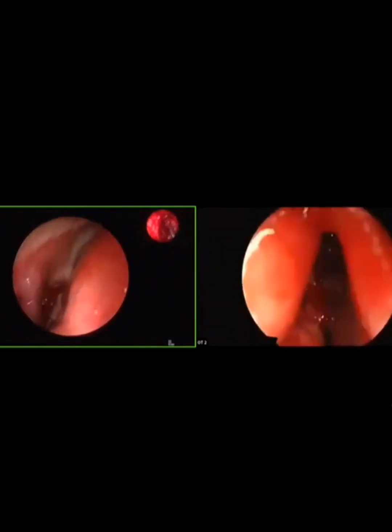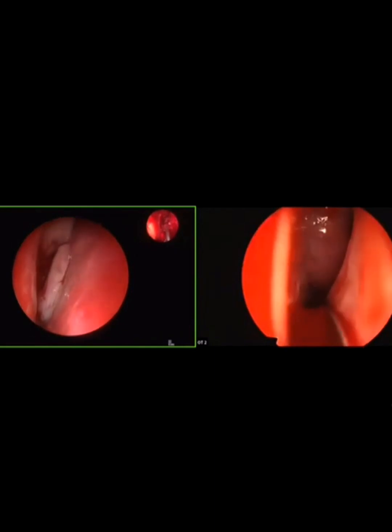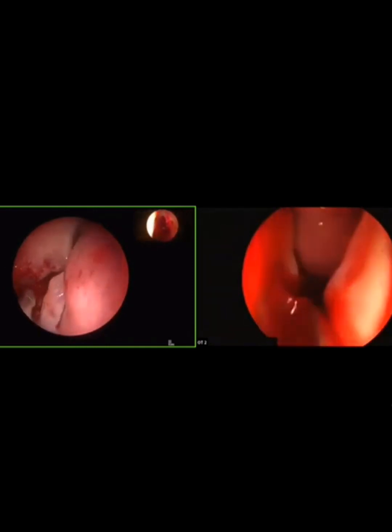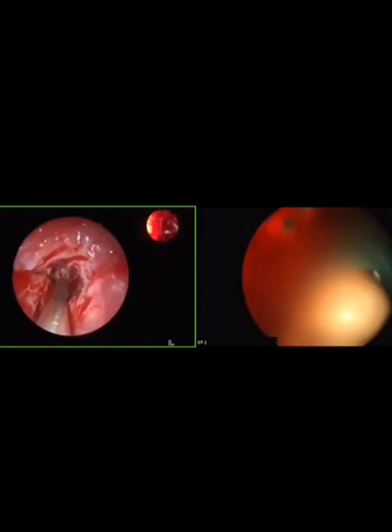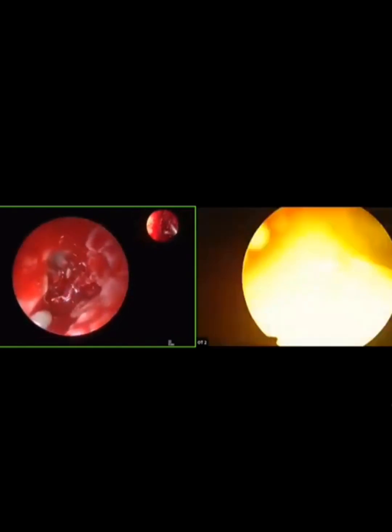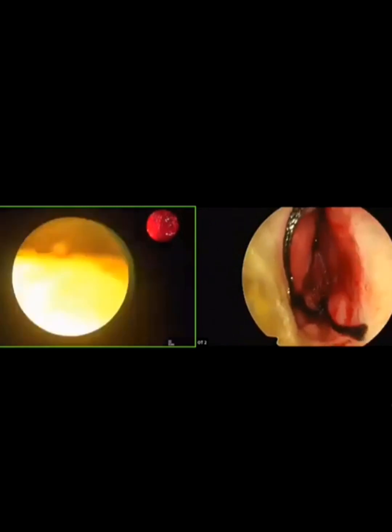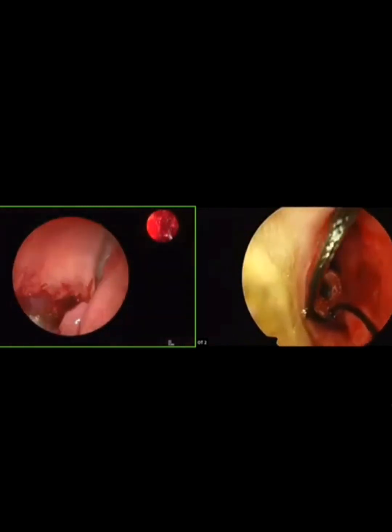In the frontal sinus, use less wash, for practical points. Otherwise we are always doing suction there, and saline will collect here and fog the endoscope. Use less wash while working with the 70-degree. Now I will remove this mucosa inside the frontal sinus and delineate the supraorbital recess and frontal sinus clearly.